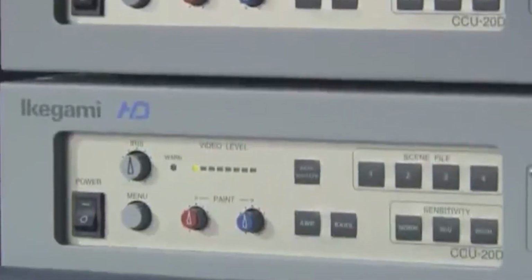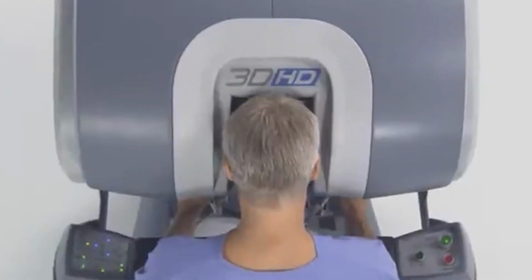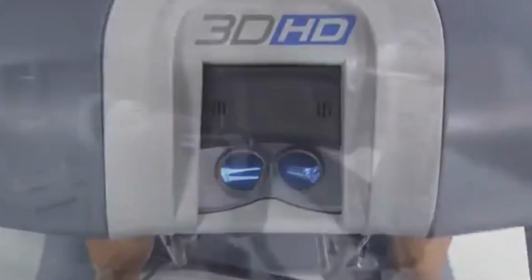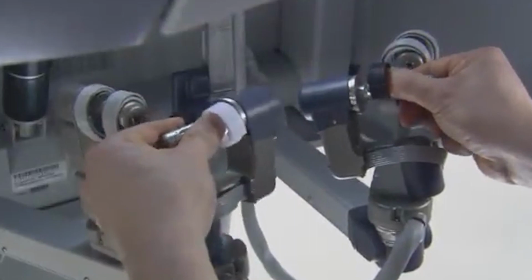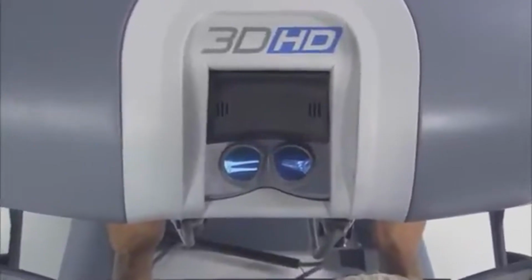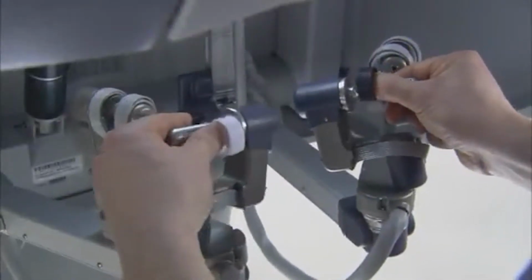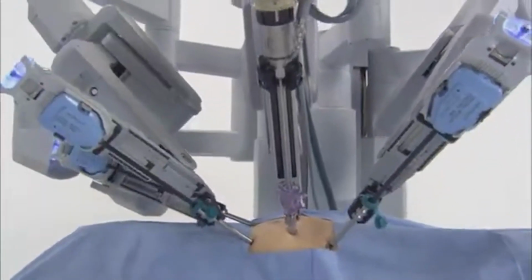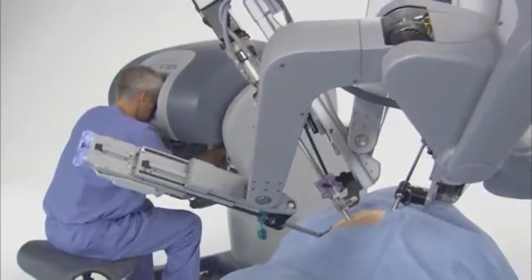A multi-armed wonderbot called Da Vinci Surgical System is being used to lower surgical errors and make surgery less intrusive for thousands of patients. The system uses enlarged 3D high-definition vision and controllers that strap to a surgeon's wrists and hands to provide them with more accurate control over a variety of procedures. Human hands might not be able to make tiny, precise incisions without the help of the Da Vinci system. This gives doctors greater control, and because the procedure is less intrusive than conventional surgery, patients recover more quickly.